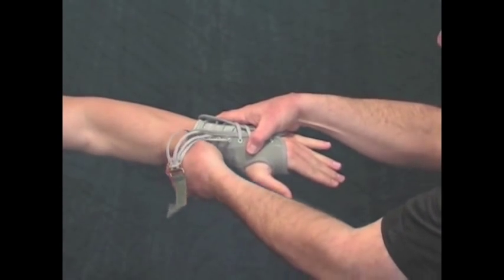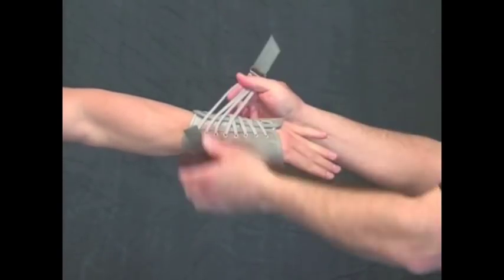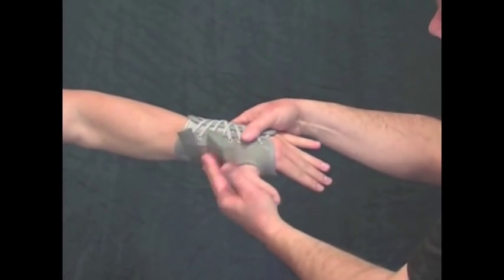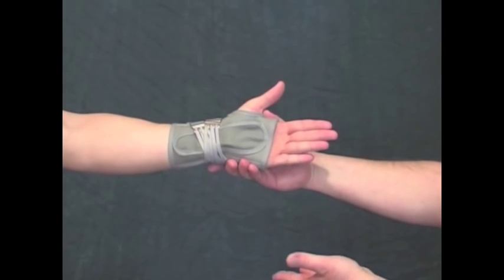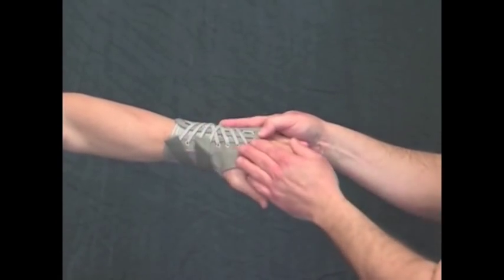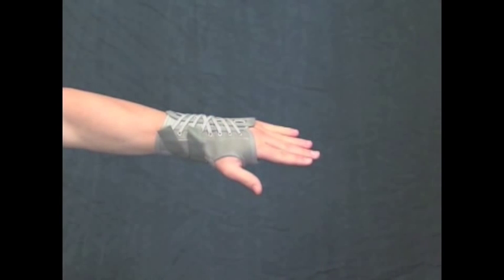Make sure that the lining underneath the lacing is not bunched up, and then fasten the closure straps snugly in a crisscross pattern. This ensures optimum support and motion control. Once the straps are securely fastened, make sure that the splint casing is centered over the palm and that there is at least some gap under the lacing on the dorsal surface.